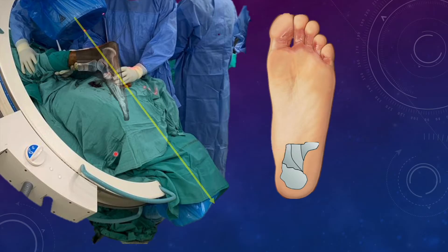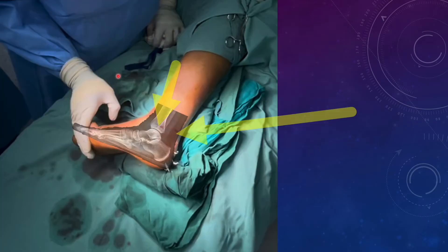It is very difficult in this particular position because everything depends upon the assistant holding the limb in this particular rotation and the amount of dorsiflexion performed while avoiding interference in this zone. If your hand comes in this zone, you are going to block the axial view. So by now, we are aware that we need two views: the lateral view, which is easy by putting the C-arm directly above the ankle, and the axial view, which is an anteroposterior view in which the beam passes parallel to the posterior facet.